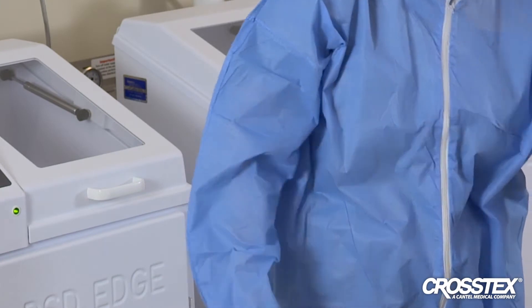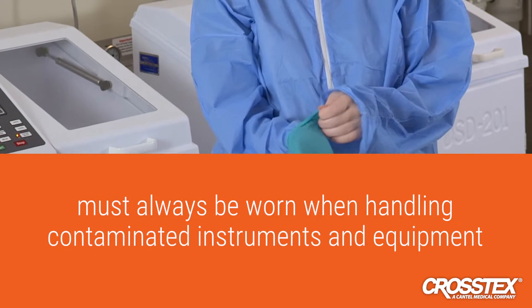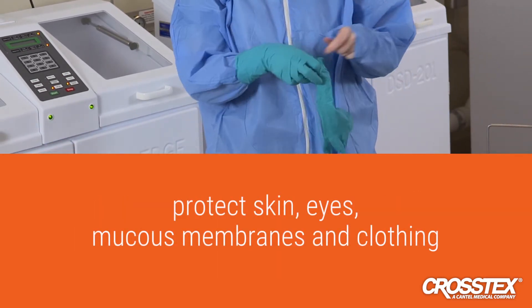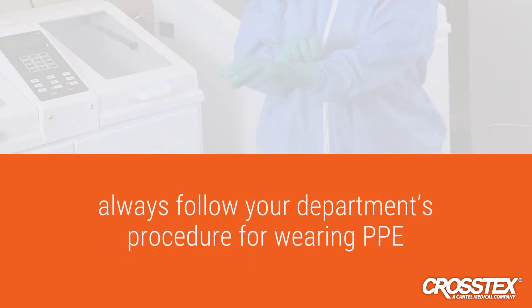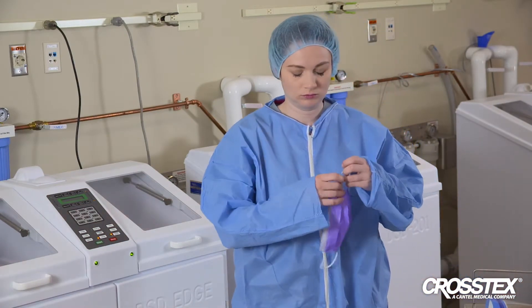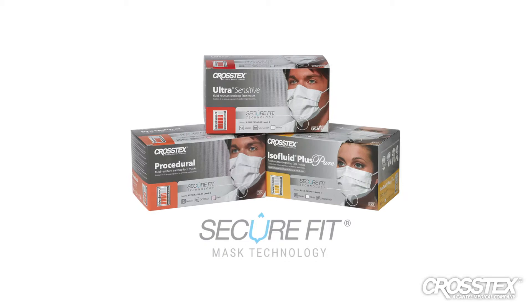Personal protective equipment, or PPE, must always be worn when handling contaminated instruments and equipment to protect skin, eyes, mucous membranes, and clothing from splashes. Always follow your department's procedure for wearing PPE when high-level disinfecting. Crosstex recommends the use of Crosstex SecureFit face masks for face protection.